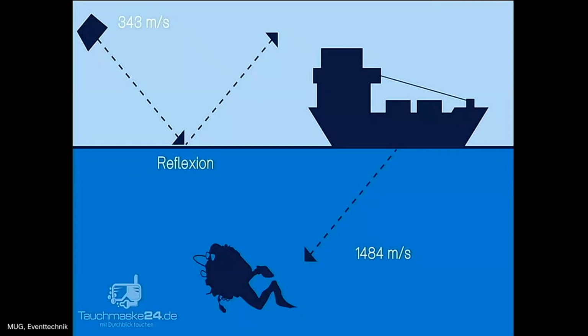In this image, you can see an impedance step happening. The diver inside of the water is not able to hear the sound of the speaker because between air and water, there's a big impedance step. And so all of the sound waves are reflected. But he's able to hear, obviously, the sound which is emitted inside of the water.